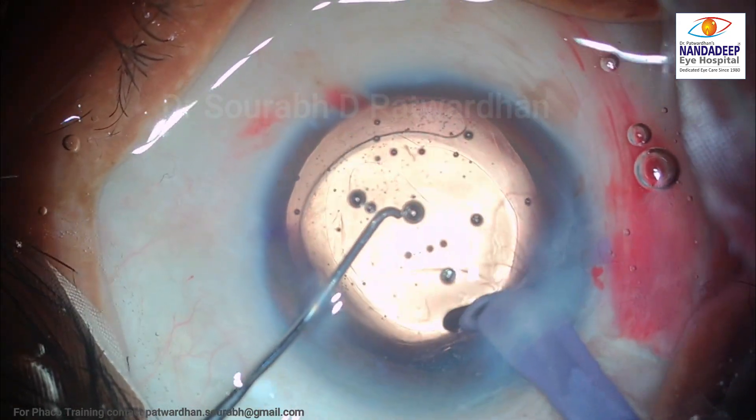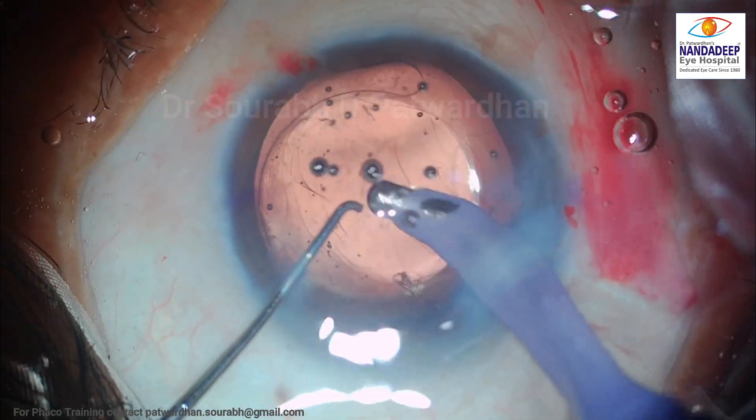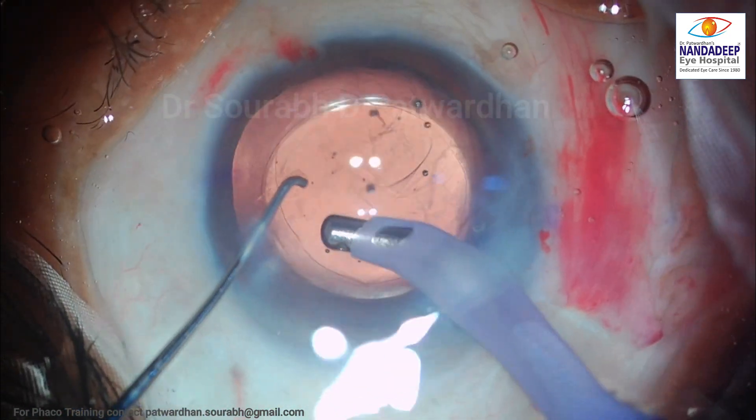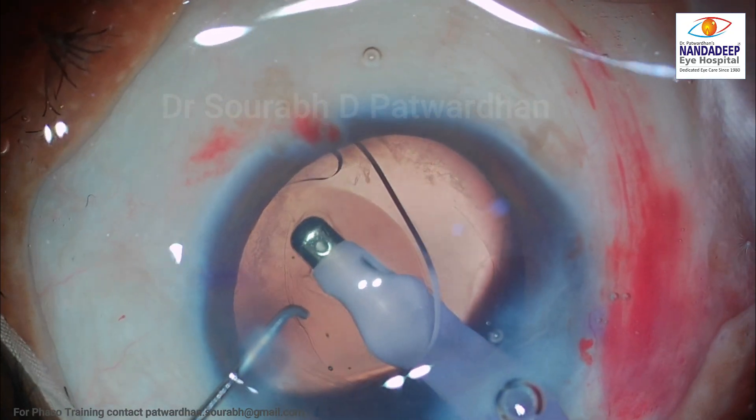As you can see, I approach the sub-incisional cortex and it has already become loose — it comes off very easily. So that is the end of cortex aspiration, and this is how we can utilize the IOL for loosening the sub-incisional cortex.